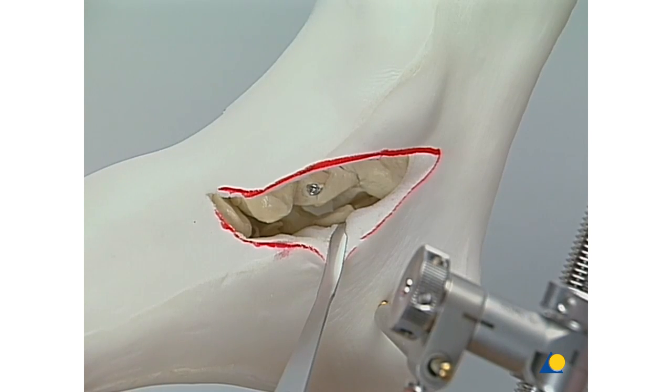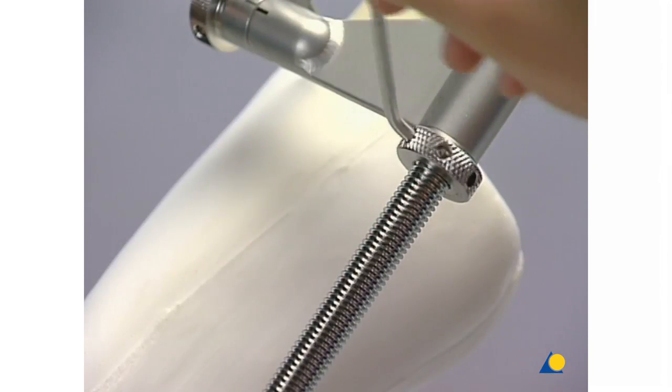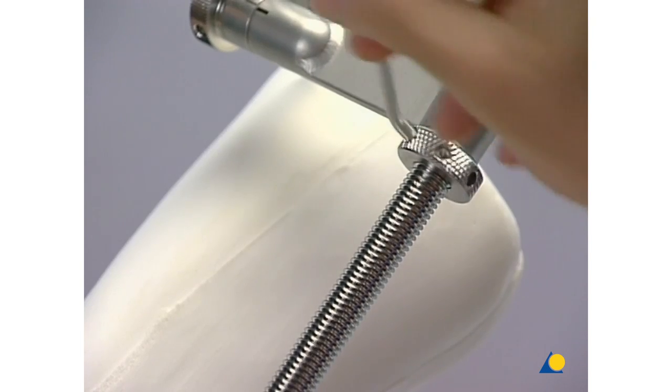The femoral distractor can now be released so that we can see how the neck of the talus fits the sustentaculum tali.